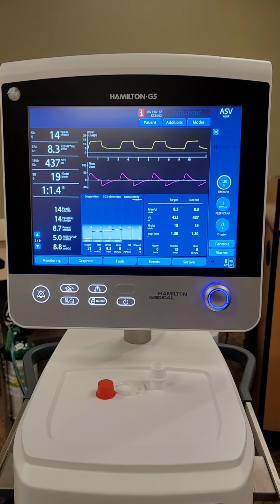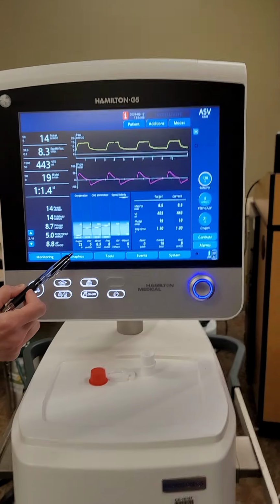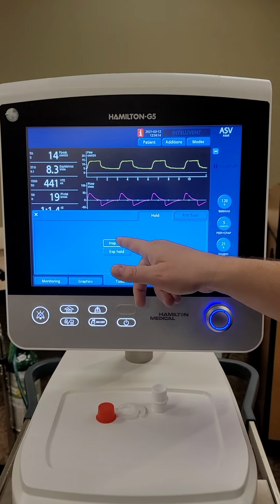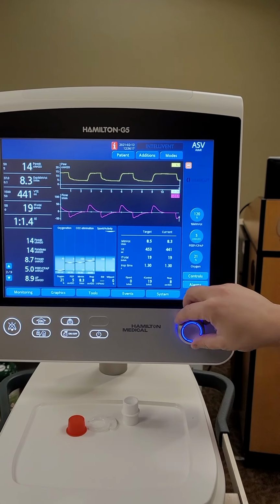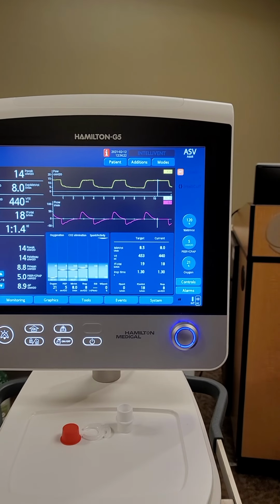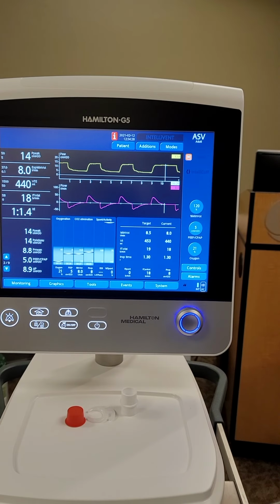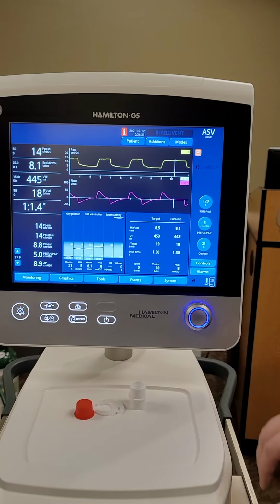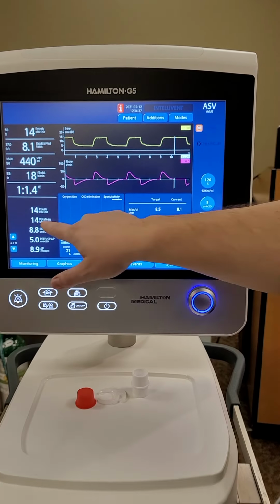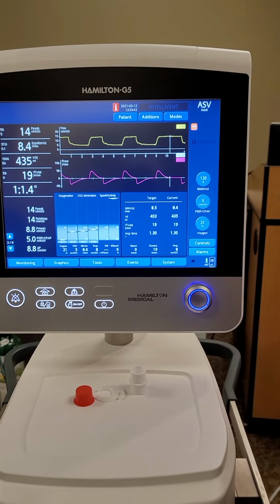What about a different topic, but when you're looking at plateau pressure, some of the graphics were showing a plateau pressure that did not match the plateau pressure when we used the tool and did the inspiratory hold. So if we do an inspiratory hold here, and then we go back, we have zero flow. If I saw this higher than my peak pressure, I know that my thing is erroneous. Is this measurement wrong, or it's just not even in there? Wait, say that again? I'm confused. All right. So this is what you're doing, right? You're saying that this number is not the same as this number. Yes. Okay. It just depends on why.